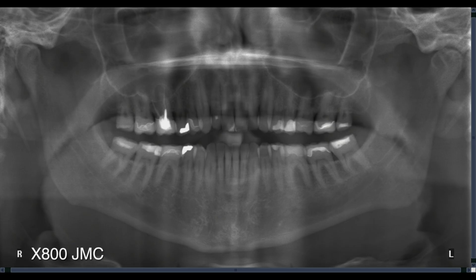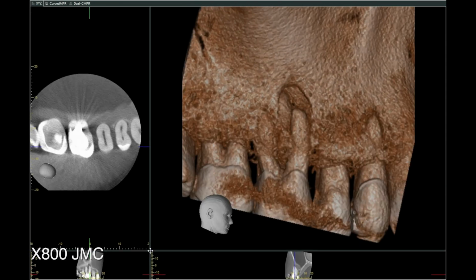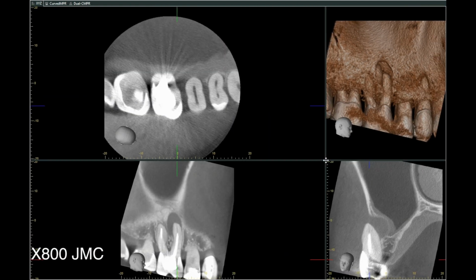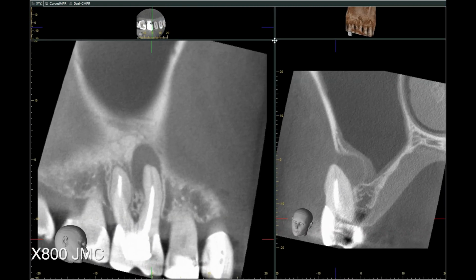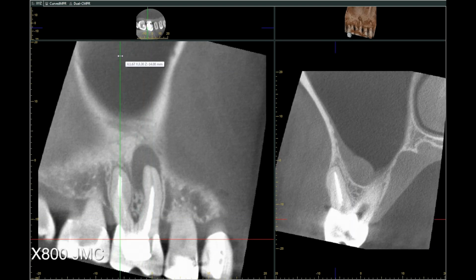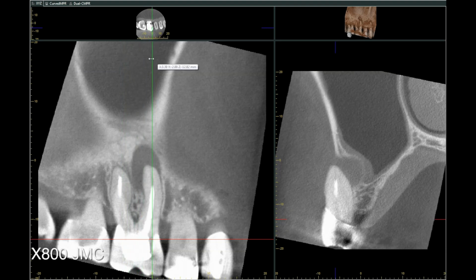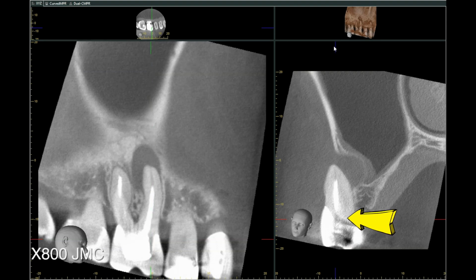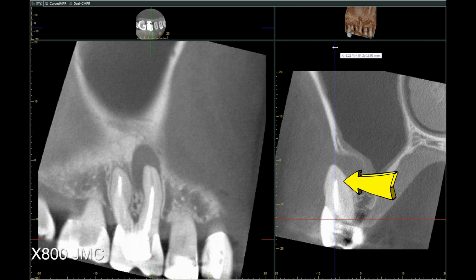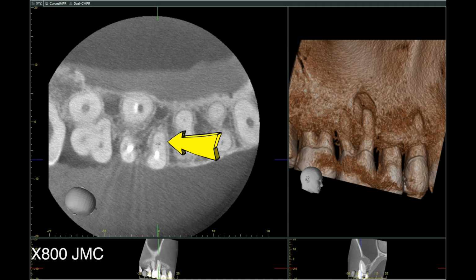So we always start in these cases with a pan showing what the overall picture is, and you can see that this patient only had this root canal therapy in their mouth, and the CT is showing us also that we have this large radiolucency and bone loss around the mesiobuccal root that's expanding a little bit into the sinus with a little bit of sinus mucositis. This patient was in severe pain in this tooth. And we can see that there's a short fill, but there is room also on the side from this coronal section on the mesiobuccal root for an MB2 that was untreated. And now looking at the axial section, we can see where the MB2 was, and it was untreated.